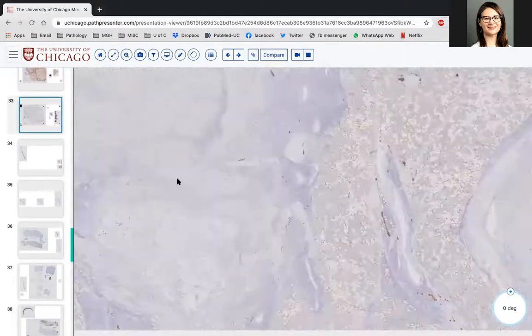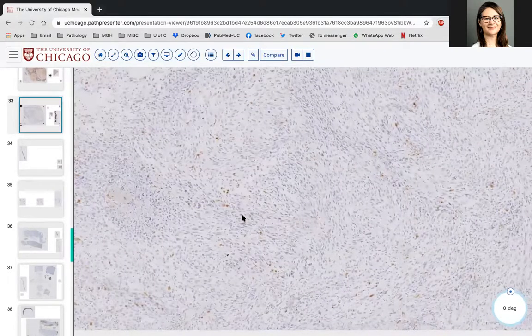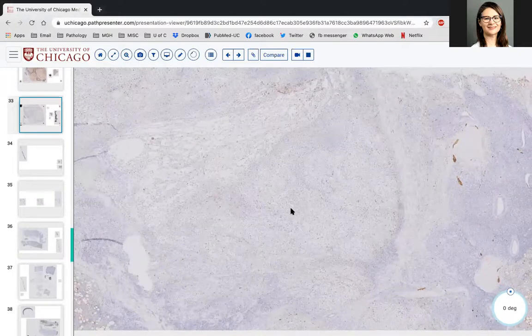So even if you read, for example, Fletcher's paper on myoepithelial carcinomas of soft tissue, they don't all express all of the relevant markers, right? So it's sort of a grab bag. Like in bag 1 is EMA and a keratin, and in bag 2 is S100, GFAP, P63, P40, calponin, SMA, and you just need essentially one from each bag.